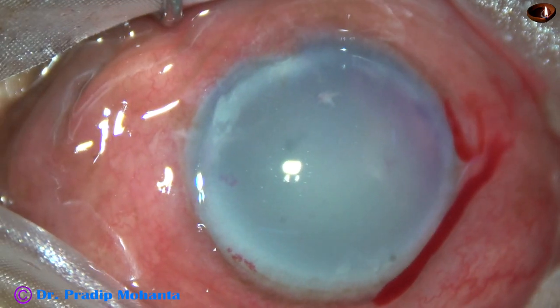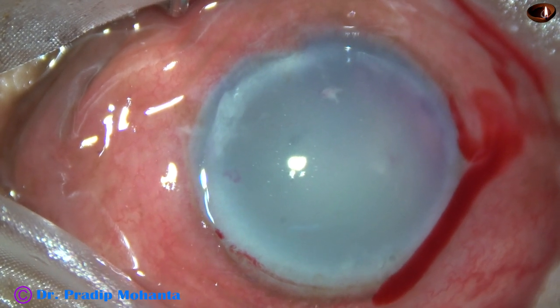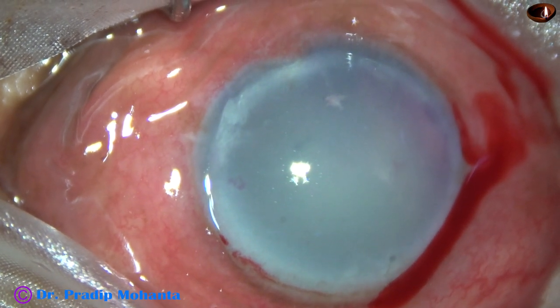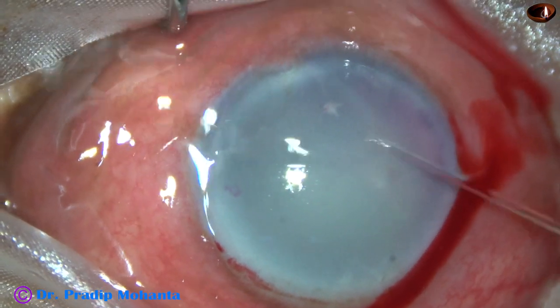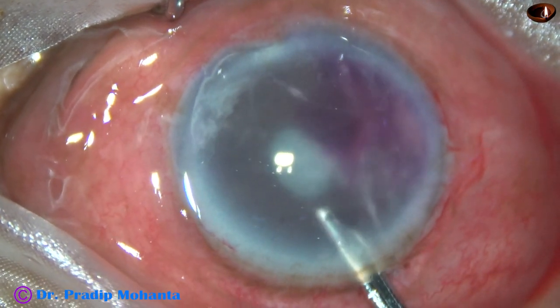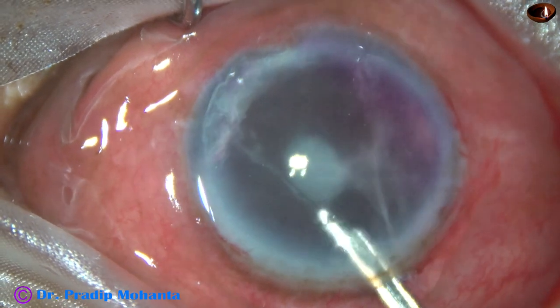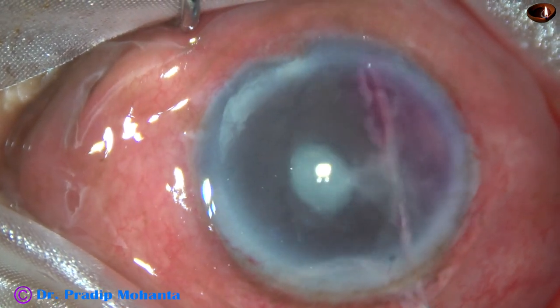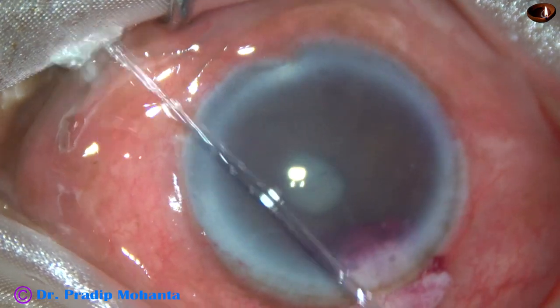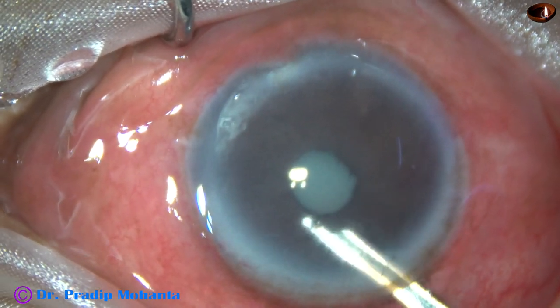I ask for a Simcoe cannula to do a lavage of the anterior chamber and see what happens. This is the 23G Simcoe cannula. We can see the iris details now. We can see some fibrinous bands — this is probably because of inflammation. You can see a bit of blood, hyphema, in the anterior chamber. And everything comes off. You can see some bleeding points here and there.